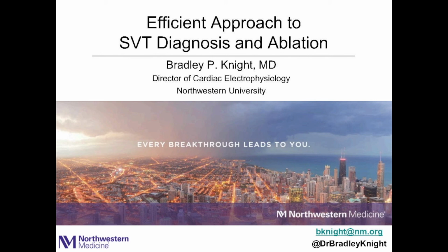Do you want to make any quick comment about perihisian pacing? Do you use it anymore now? We've gotten techniques where we don't have to use it too much. Yeah, so perihisian pacing is a good way to differentiate an accessory pathway near the septum that conducts more rapidly than the AV node. So I think people misunderstand that it's going to be useful in a long RP tachycardia where the pathway conduction may take longer than the AV node. So we do perihisian pacing a lot before and after ablation still.